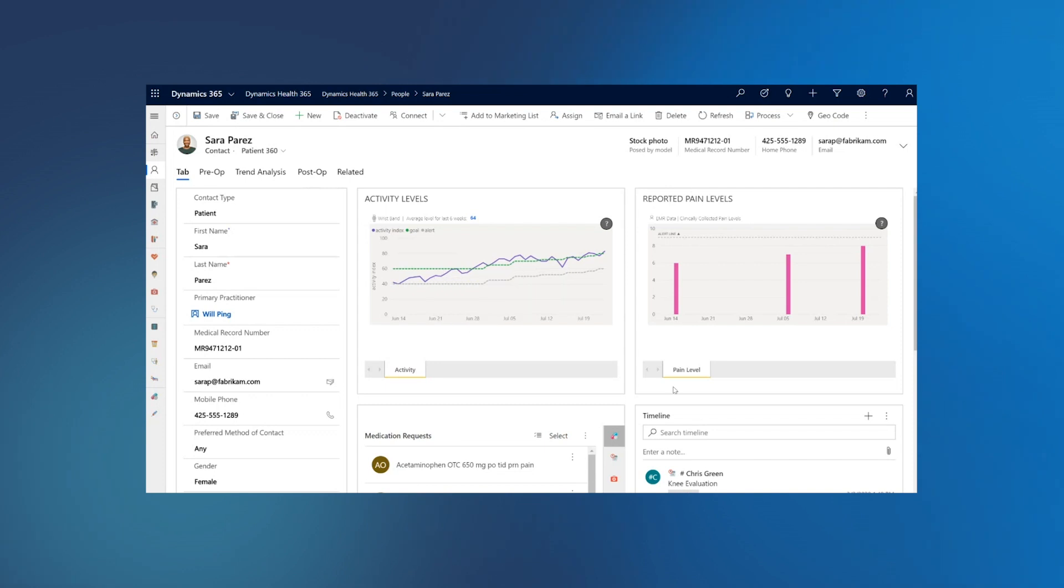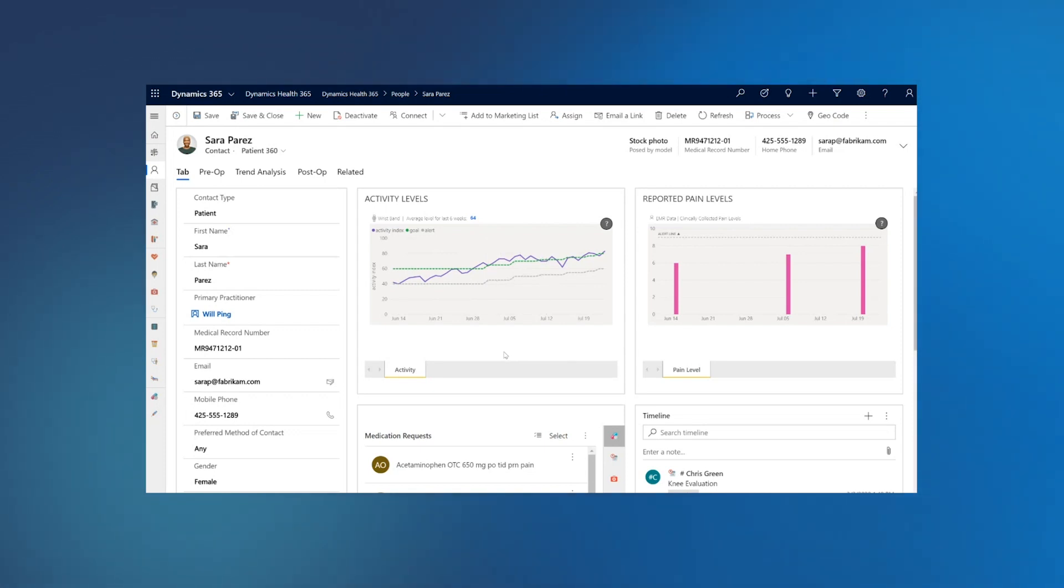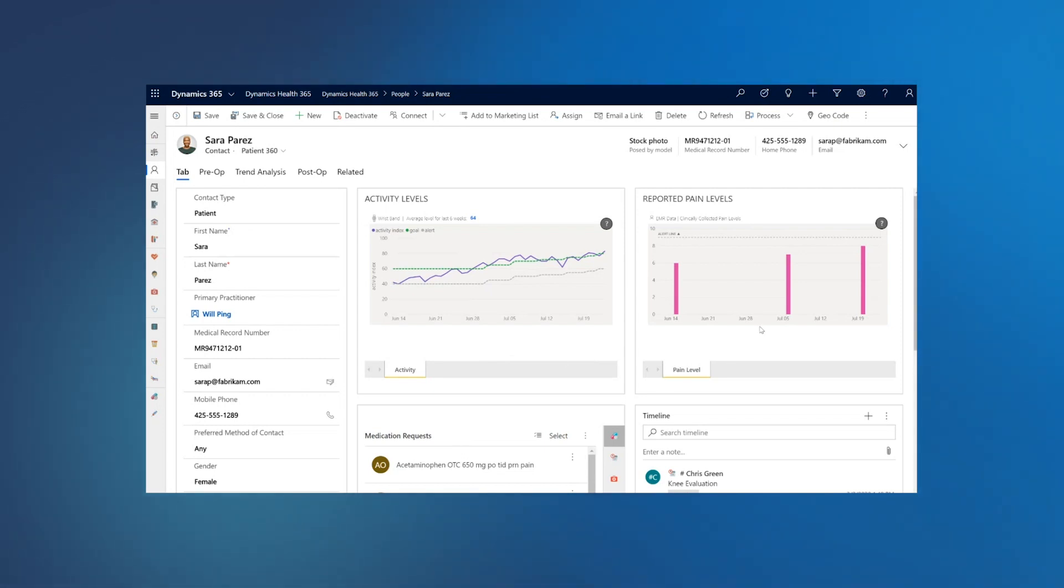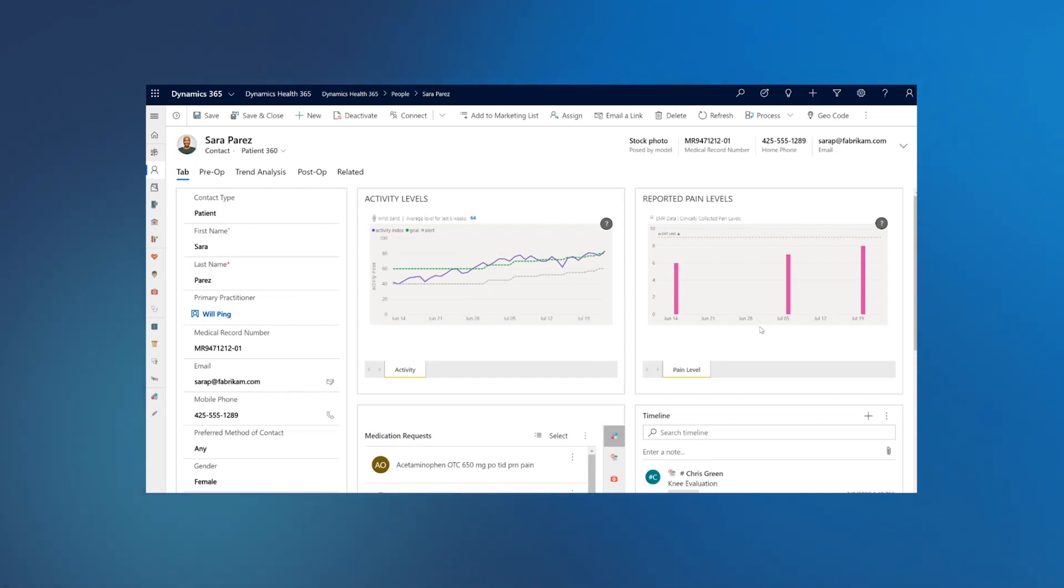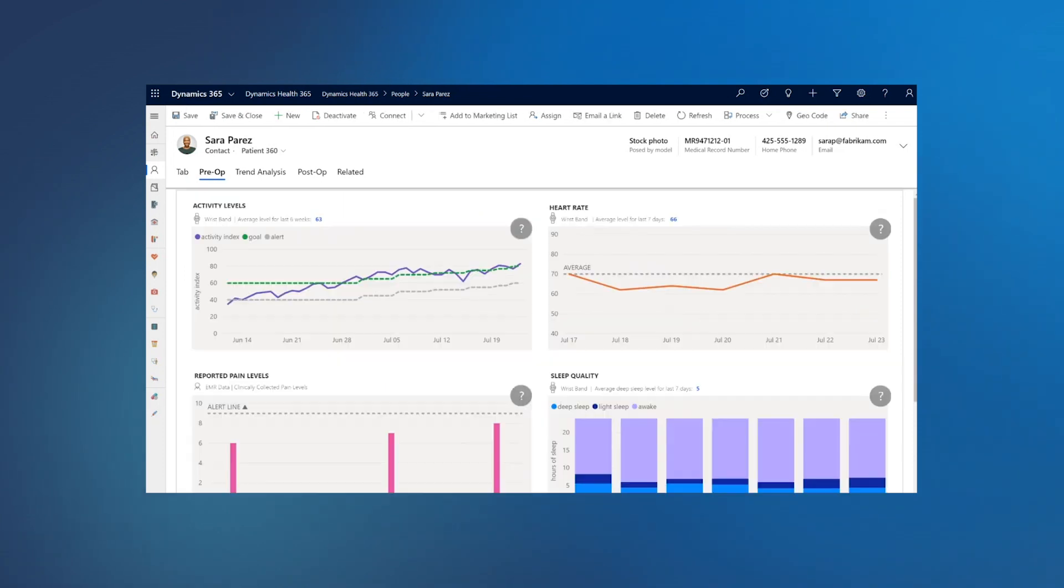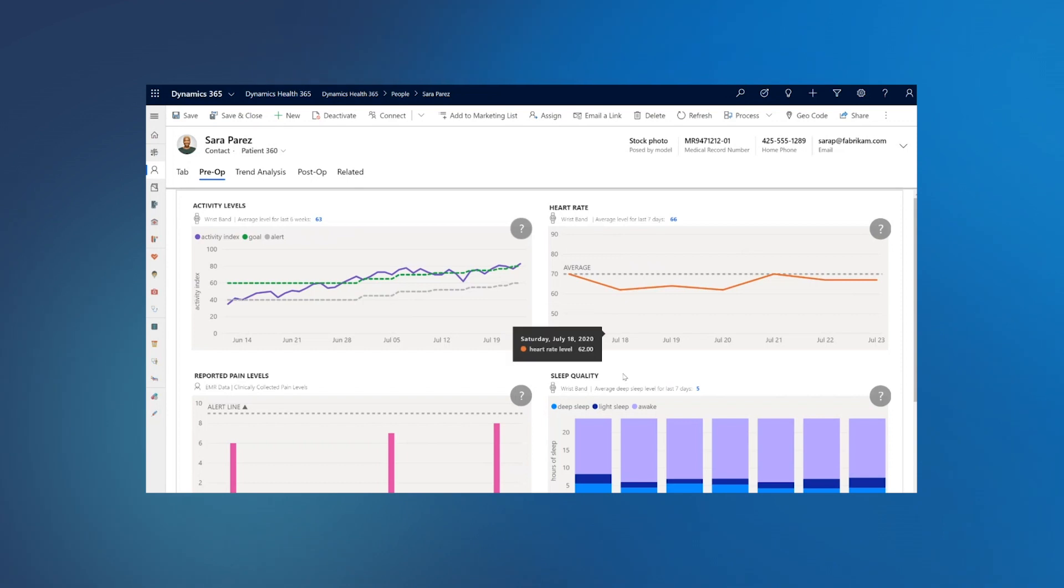In this dashboard, a care team can see Sarah's pre-op activity data, but along with it, a care team can also see her medication data, her reported pain level data, which is coming from EMR, and this is where Power of FHIR comes in, which allows you to bring data from different sources and interoperate them, aggregate them for longitudinal view of the patient. Care team can also go and do a deep dive in the data. Care team can look at heart rate, sleep quality as well.